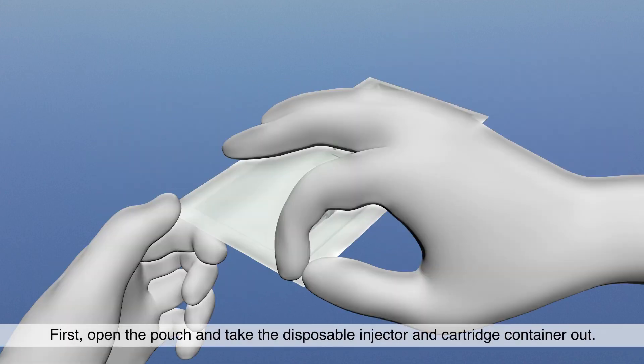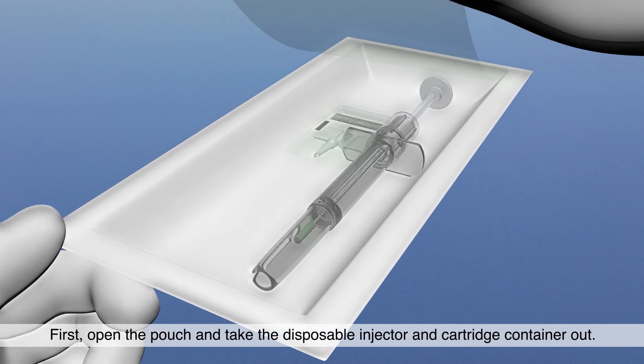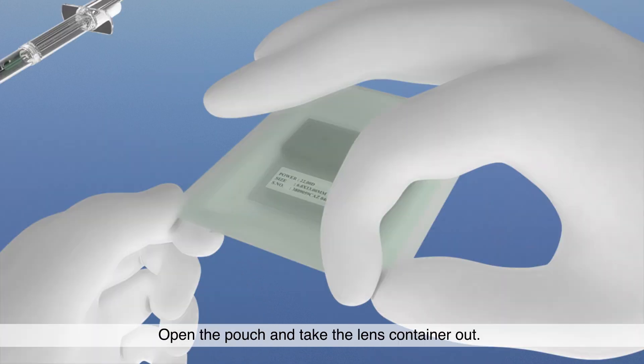First, open the pouch and take the disposable injector and cartridge container out. Open the pouch and take the lens container out.